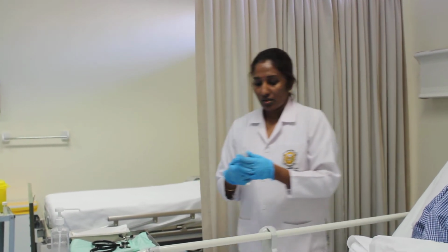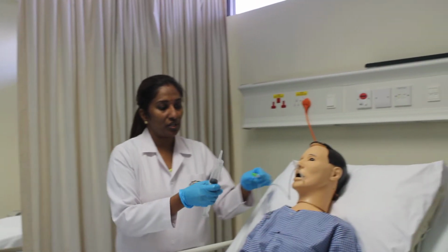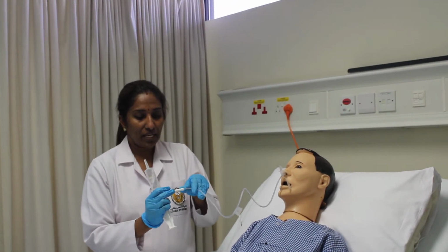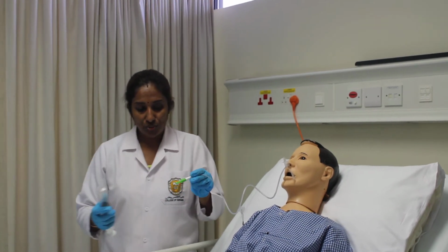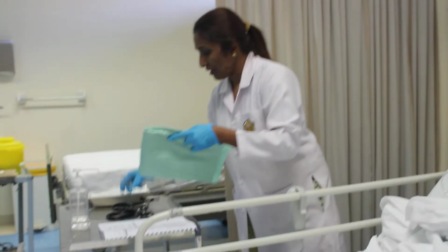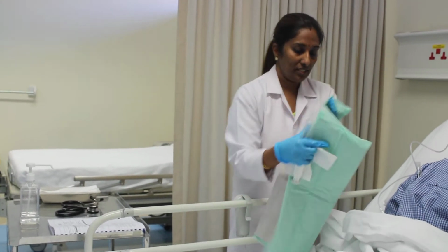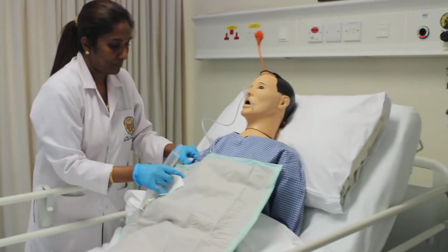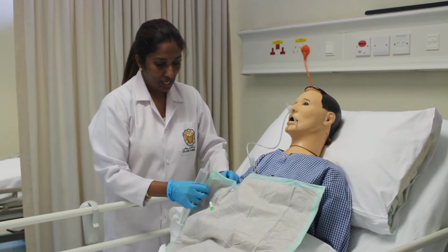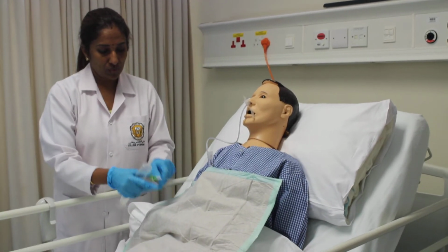It's optional, but you can inject 50 ml of air, just air, into the tube before removal, so that if there is any fluid along the tube, this will be completely removed. Whenever you are removing, you have to make sure that you are pinching the tube. Also, for the safety of the patient linen, you can place an underpad sheet across the chest of the patient, and you will give a tissue paper. Sir, you can keep this in your hand, and if you want to wipe your face after the removal or in between, you can use this.